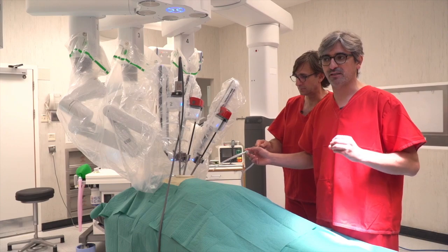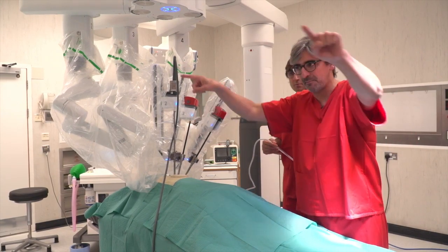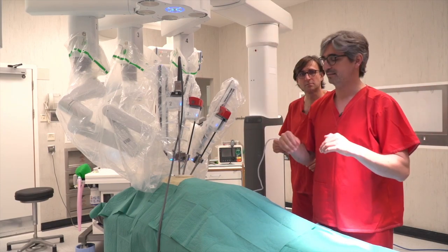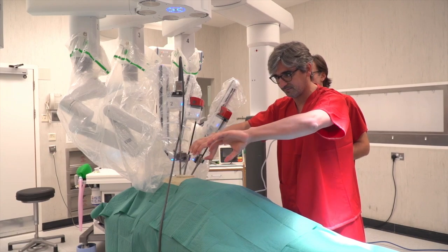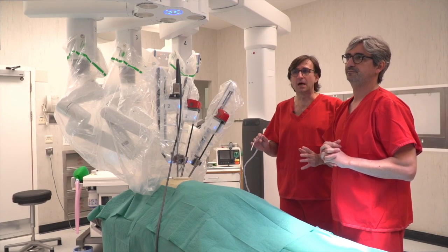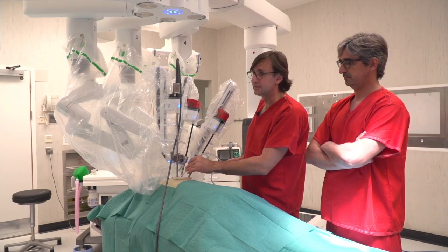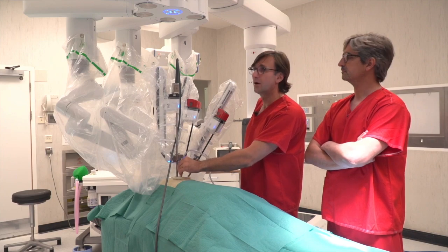The good thing about being uniportal RATS is that you don't need too many instruments. You don't need raspers to retract because you work like this, and everything that happens around doesn't matter. It's not like multi-portal RATS where you have instruments coming from here and here. In uniportal RATS you go like this, so with the robot you can retract and work. The assistant must not interfere all the time — only when needed. The suction must be kept as much as possible near the camera trocar — that's the best position. Always under the surgeon instruments, not between them, because you will hurt the dissection field.